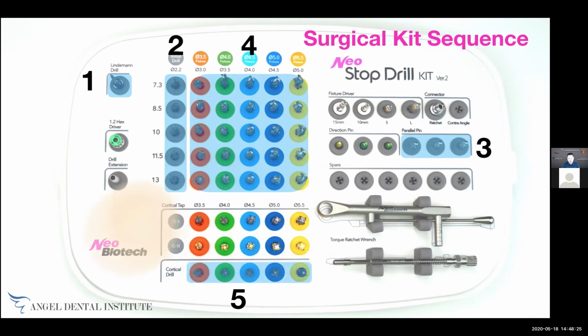And then you would want to tap, depending on which implant system you're putting. Is it the IS2 implant system or IS3? Those are Neobiotech implants. The newest one is IS3, but I use IS2, have no problem with that. So if I'm using IS2, I would use one of these taps. Then I place the fixture using the fixture driver.